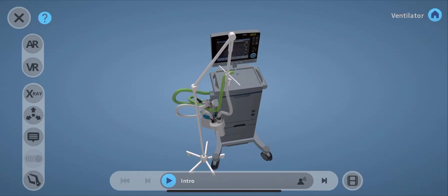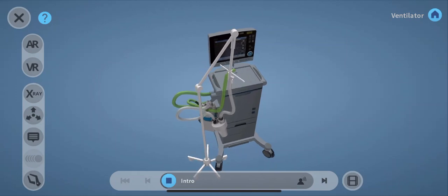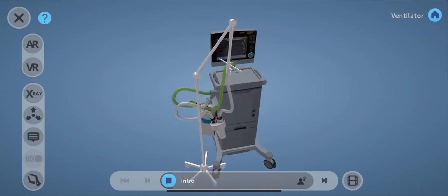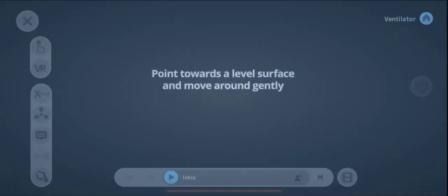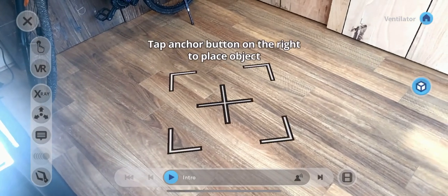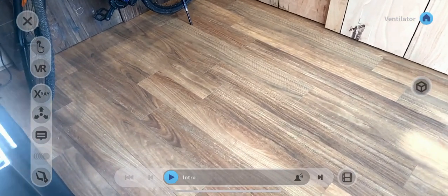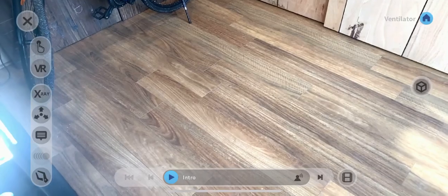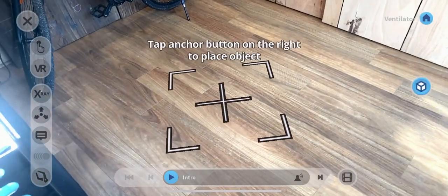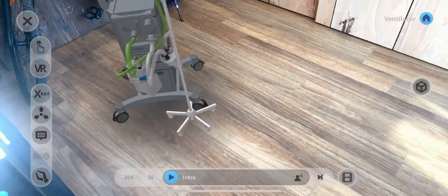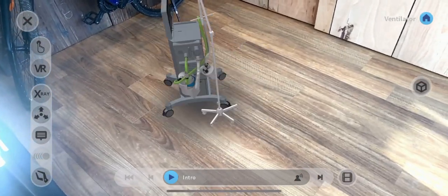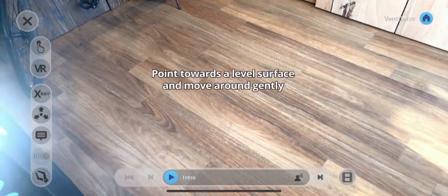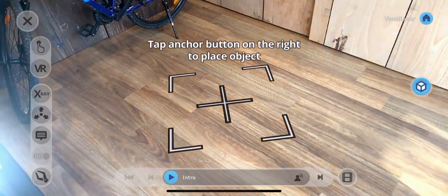But I just want you to listen to what goes through it. Maquet Servoi ventilators are an essential part of patient care. I'm just going to put it in AR mode. It's trying to find the ground. There we go.